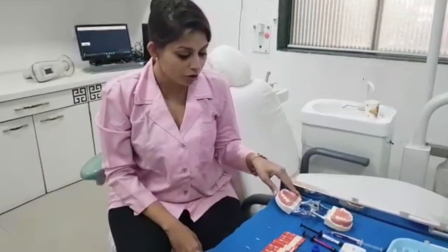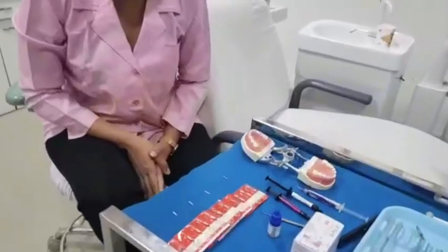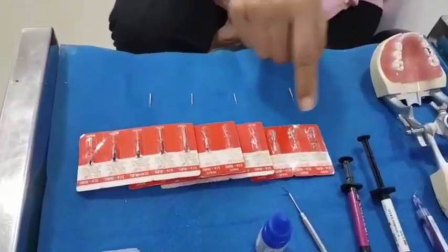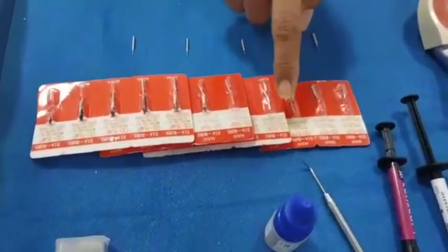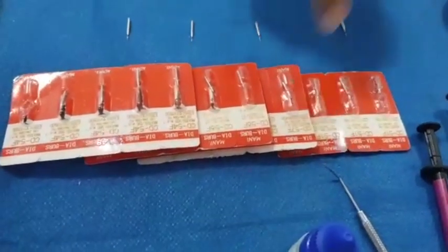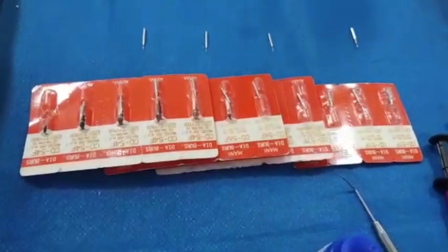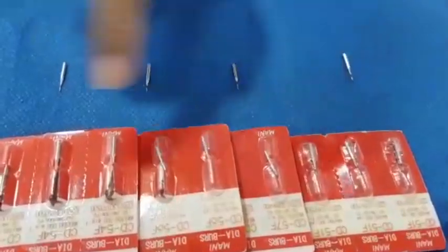What I would like to show you before we start with the procedure is the armamentarium. So here we have a few burrs. These are from MANI and they are titled as CD — CD stands for children's dentistry. Here we can see the numericals on the burrs: CD51F, CD57F, CD56F, CD54F. And these are the various heads of those same burrs.